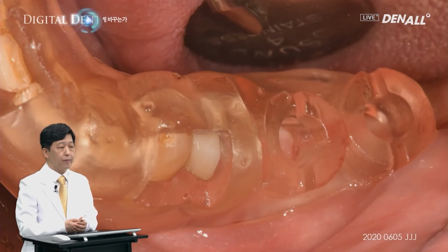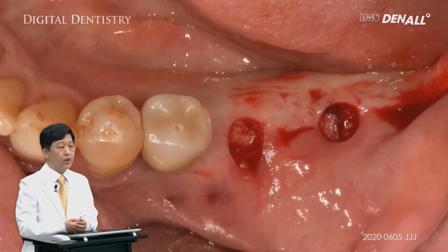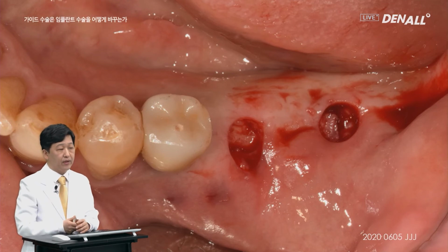In this case, if you use a guide, you punch out the soft tissue. You can see that the soft tissue is very thin. If you open a flap and place an alveolar crest level implant, then there can be issues related to biologic width. It is much more favorable to use a guide to place the implant.